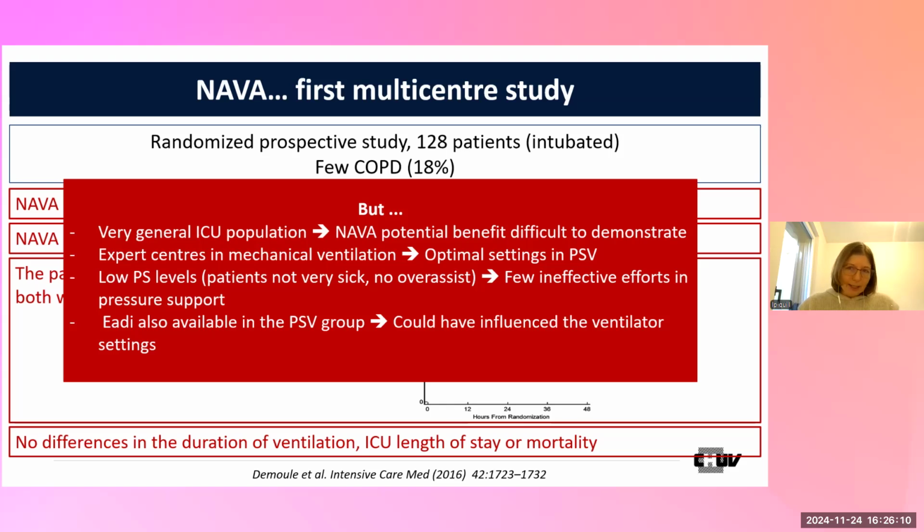And finally, and this is maybe the most important limitation of this study, the electrical activity of the diaphragm was displayed on the screen also for the patients in pressure support ventilation. And we can clearly imagine that having the electrical activity of the diaphragm on the screen could have influenced the ventilator settings during pressure support ventilation.